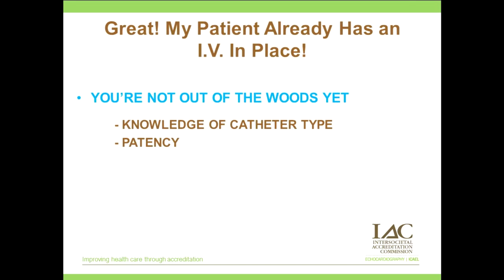So I finished the pre-contrast images and quickly went to get the contrast. And always before administering the contrast, it's protocol to flush an existing line with saline. So just as I began to flush the line, the patient told me, oh, that IV hadn't worked this morning, and the nurse was going to give me a new one later today. So I had to call the patient's nurse to come down to start the new IV. The nurse arrived approximately 20 minutes after I called, and yes, this situation really did slow me down. So again, always check for patency sooner rather than later so you can, if necessary, get the IV process started early on.